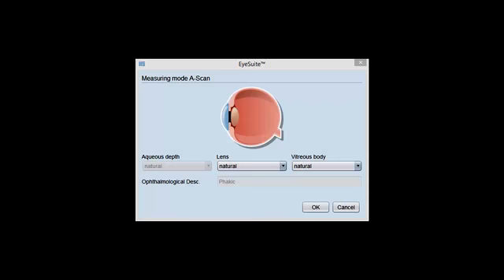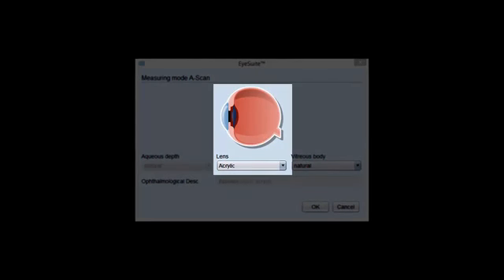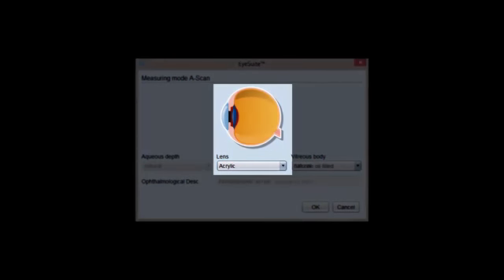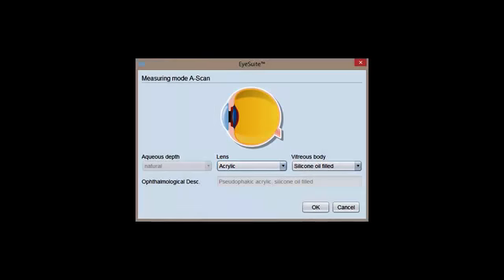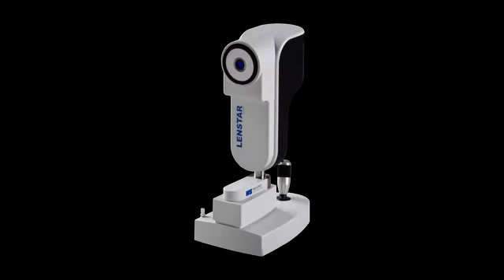The iSuite software offers variable measuring modes, including regular eye, aphakic, side of aphakic, and silicone oil filter. Five sequential scans during the capture process are recommended to obtain more data points.